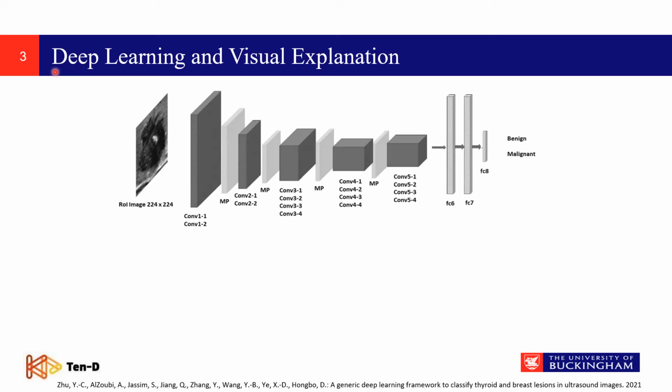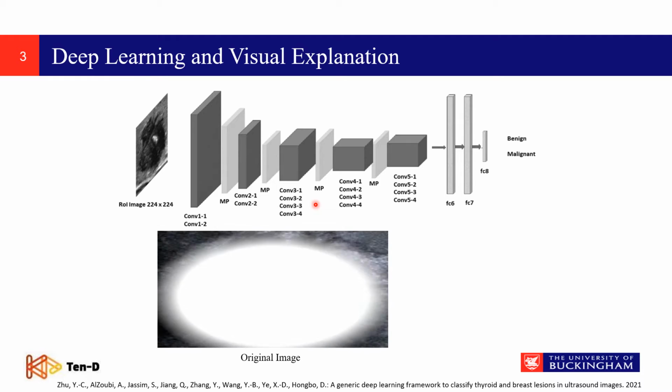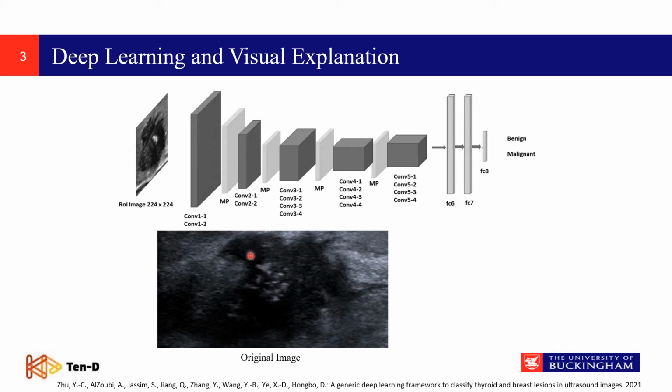In recent years, several CAD systems have been developed for classification of breast ultrasound images, and they reach a very good performance. However, these models have the limitation of not being able to explain their classification decisions, and in particular, there is a strong need to explain the CNN decisions in medical applications due to the fact that many doctors are really concerned about this black box style decision making. For instance, consider a model that will tell us it's 100% sure that it captures a malignant lesion. But the main and the most important question is why and how.